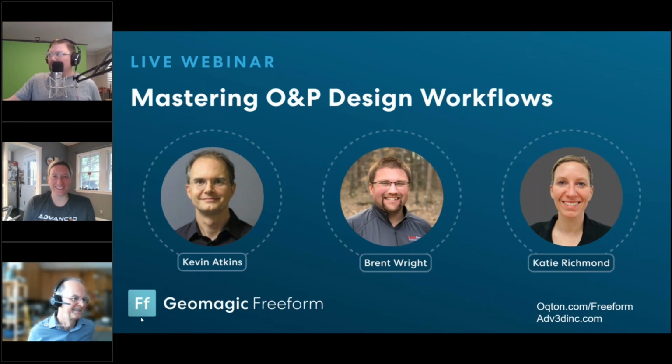That's amazing. What skill set is required for a new user to implement automation? Katie, you want to take that one? You might be muted. I mean, I didn't know how to do any of it, and there's a little PDF that briefly describes it, so reading that and doing it.